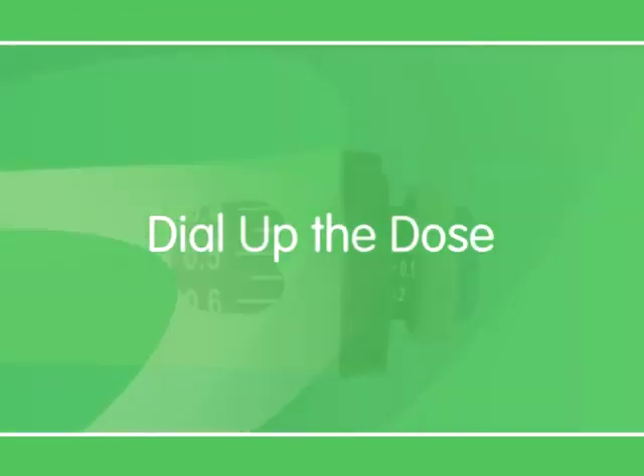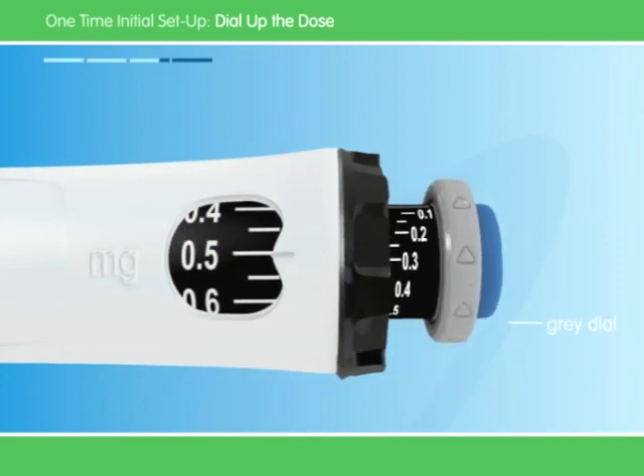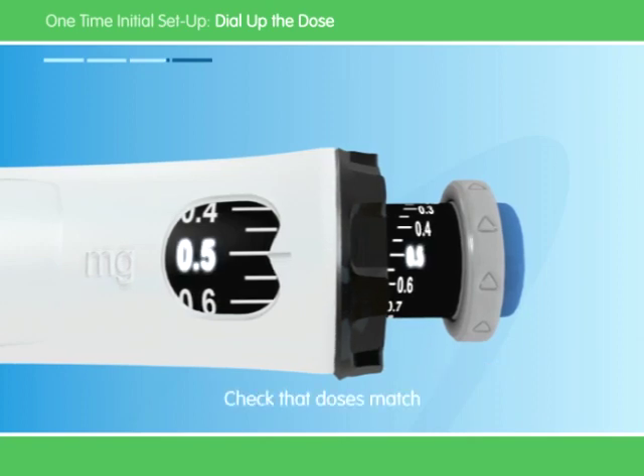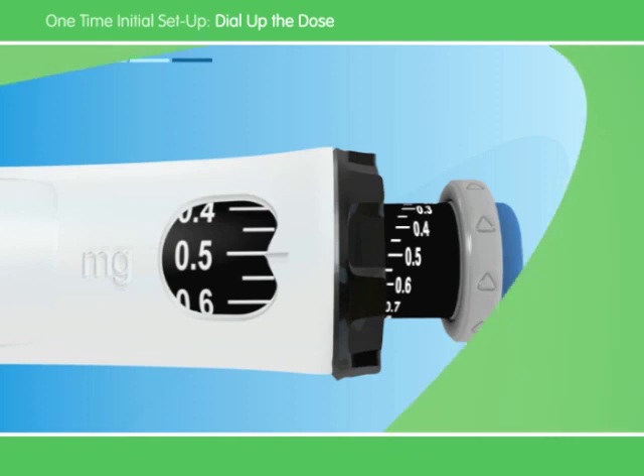Now that you've set the dose, you need to make sure the right amount of growth hormone is ready to use. Turn the gray dial in the direction of the arrows until the clicking stops. Your dose on the black rod should line up with the white pointer. Make sure the number in the black rod is the same as the number in the memory window. If the doses don't match, click the gray dial in the direction of the arrow until it doesn't click anymore.